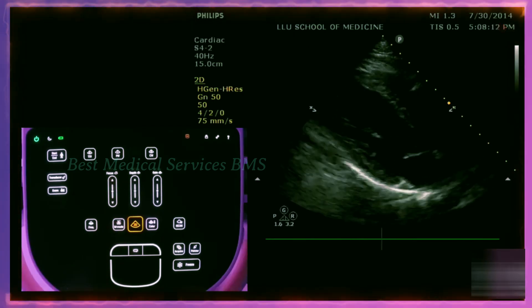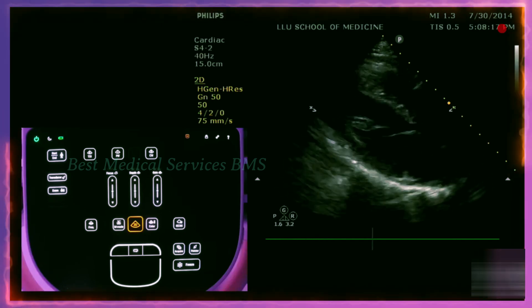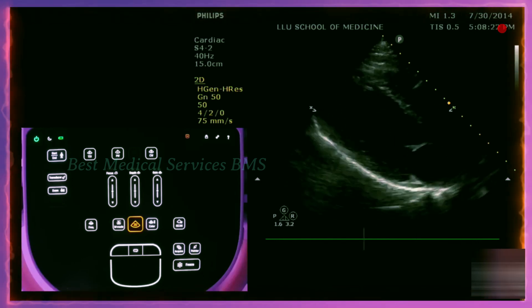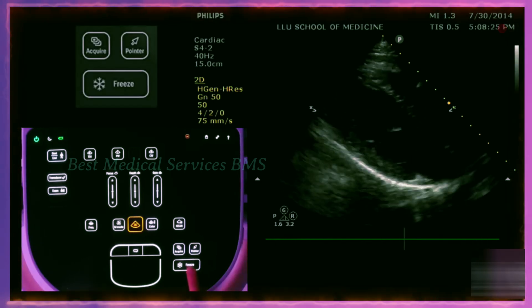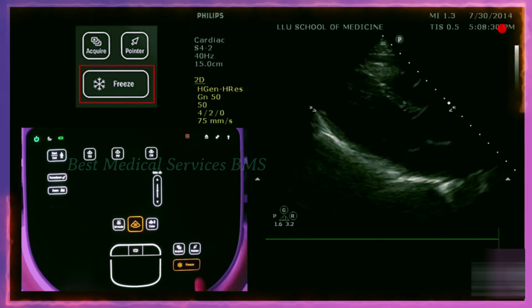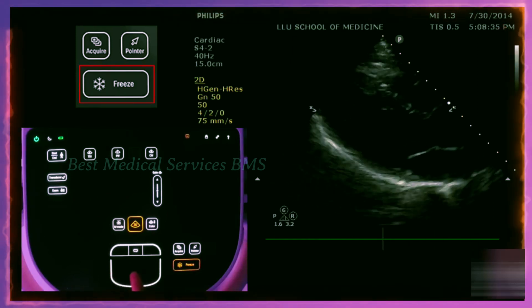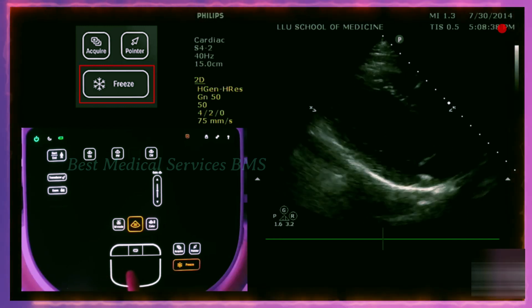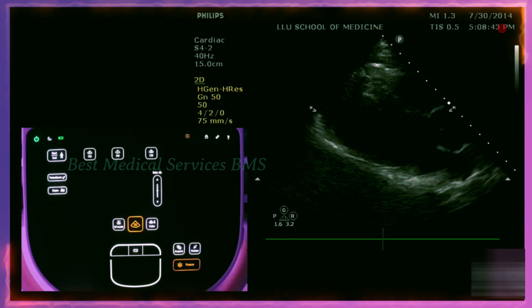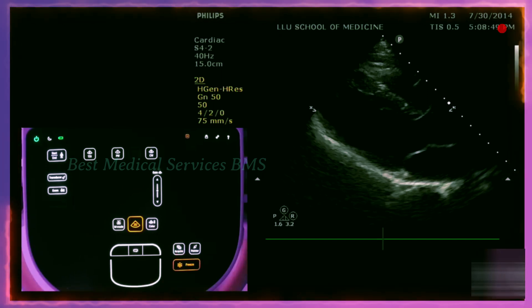Another important application is using the freeze button. When you have a structure moving fast and want to examine a single image at one point in time, you can freeze the image and then scroll back. Here is the parasternal long axis view of the heart — I'm going to freeze the image. It freezes, and you can also scroll back a few beats to see a certain area of interest. If you push acquire or save, it will save that image to the system so you can review it later.